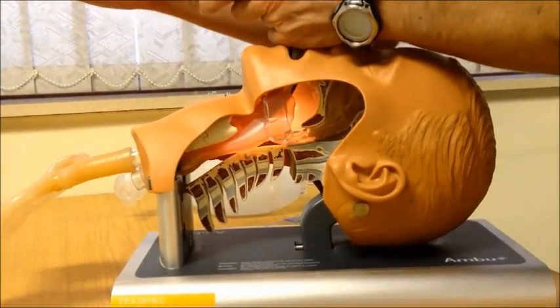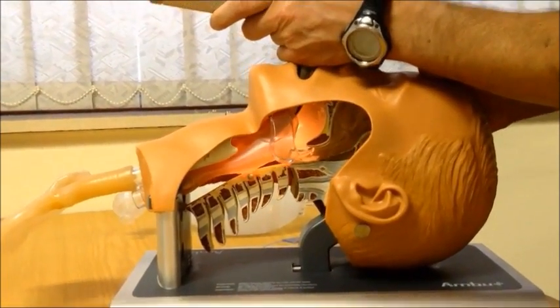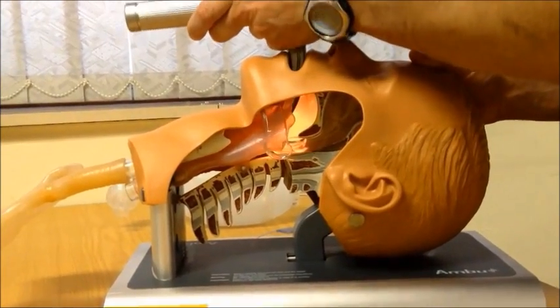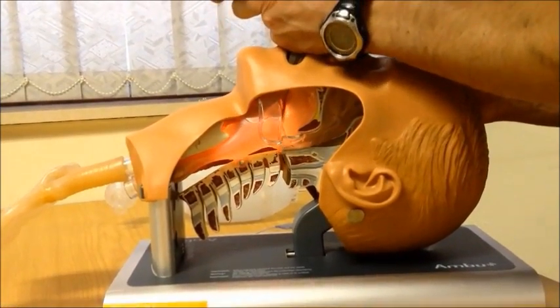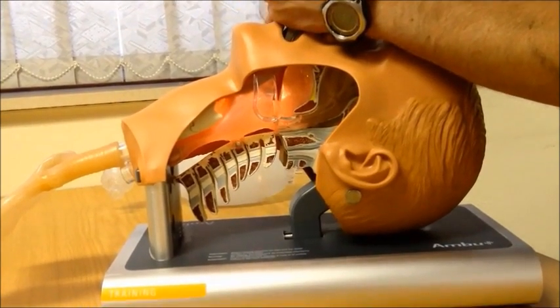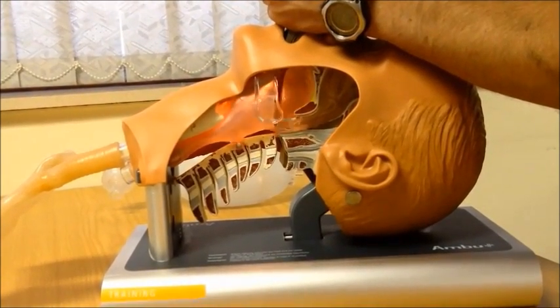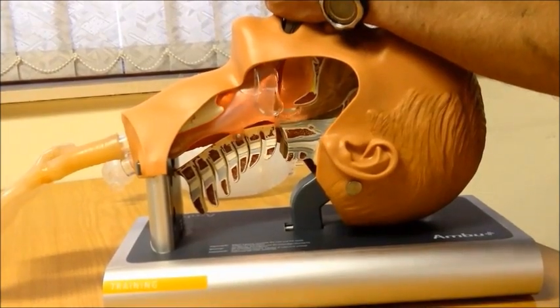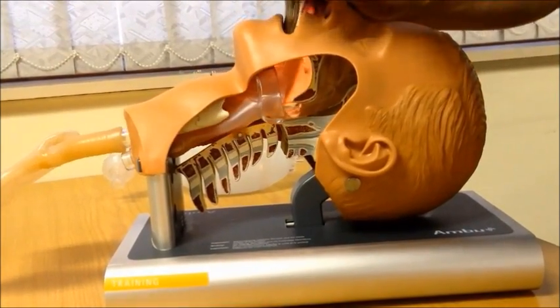You should rather pull the entire device in the direction that the handle is showing. So if you advance it down until you can see the epiglottis and then pull the device up, you visualize the vocal cords and then pass the endotracheal tube through.